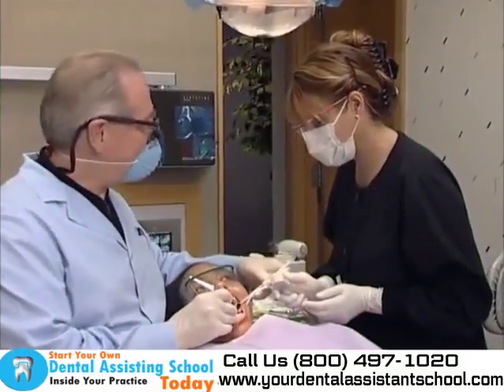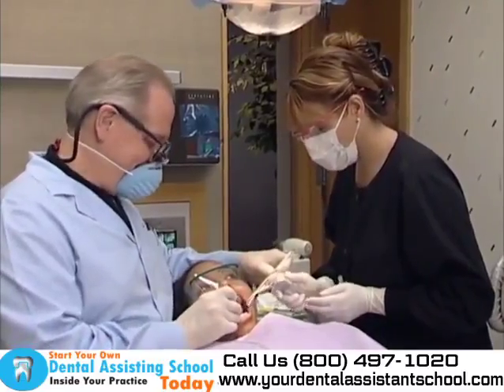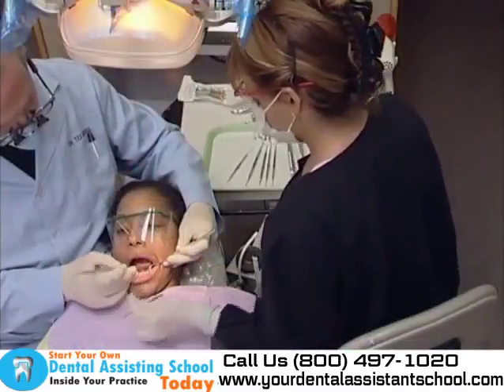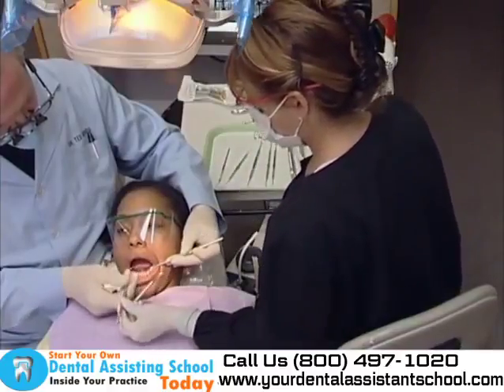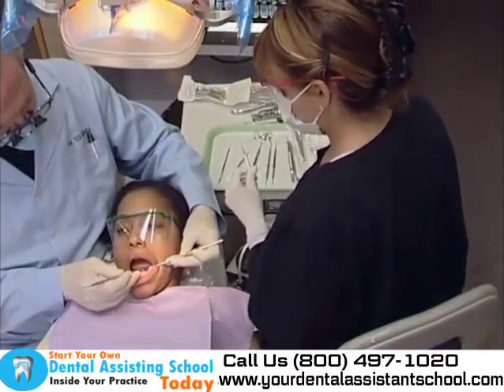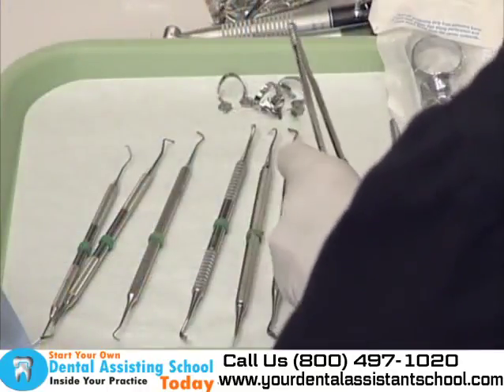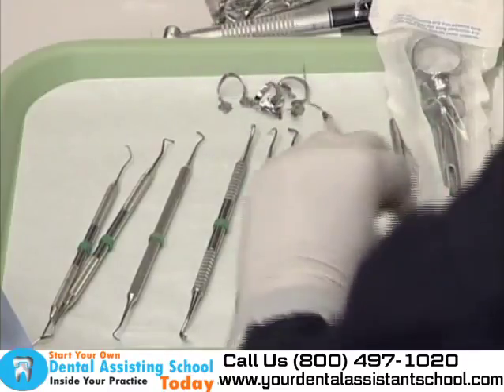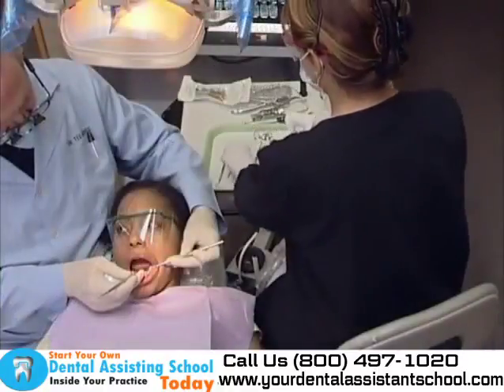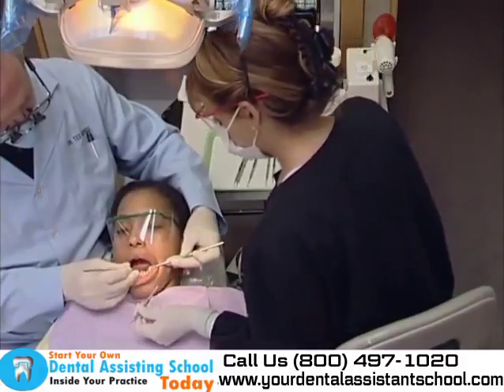Chairside assisting is one of the most important aspects of a dental assistant's day. Familiarity with the names and purposes of the instruments and handpieces allow the procedure to occur efficiently and without unnecessary movement. Setups differ depending on the dental practice and the dentist's personal preference. The dental assistant needs to be familiar with the correct setups for his or her dental office.